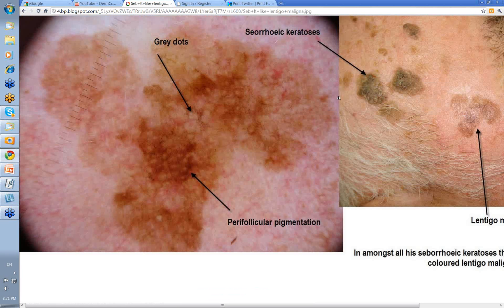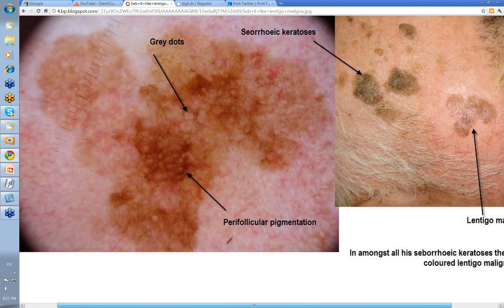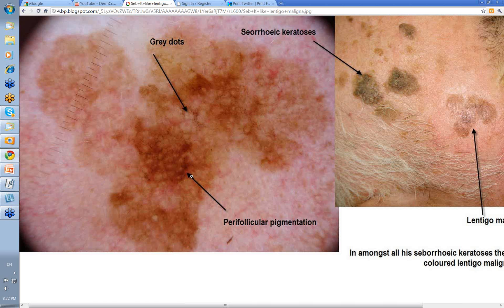What about this one? This was a lesion on a gentleman's face — he had lots of lesions, including solar keratoses, and then this one as well. It looked like a pigmented seborrhoeic keratosis but it wasn't rough and was the same color. When you look with a dermatoscope, here's the accentuated perifollicular pigmentation, some gray dots tending to form gray circles. Though you might think that's a polygon, they're not quite as reliable in distinguishing lentigo maligna on the face as they are elsewhere. But this was a lentigo maligna melanoma in situ.